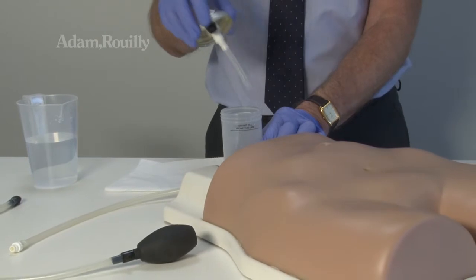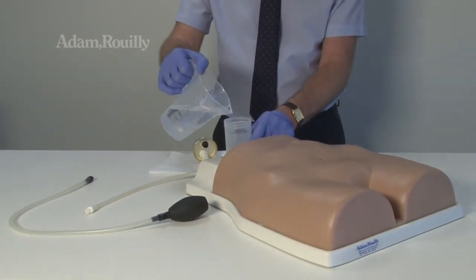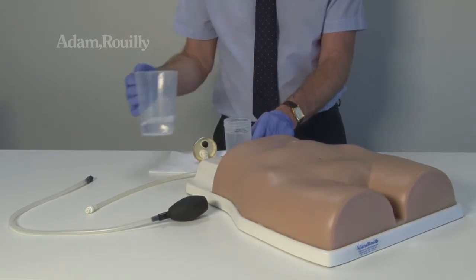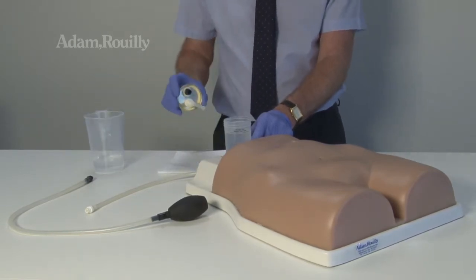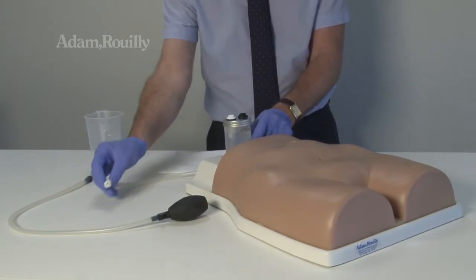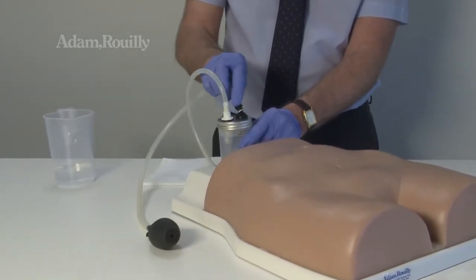To prepare for training, fill the container with water observing the max level line. Replace the cap and attach the black and white connectors on the tube to their corresponding connectors on the bottle cap.